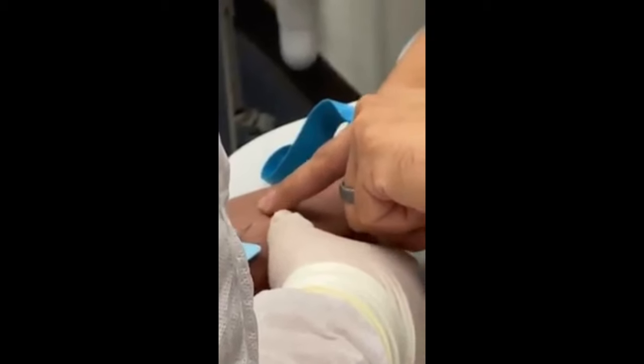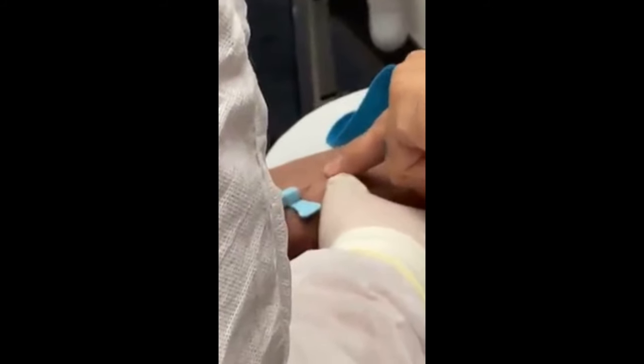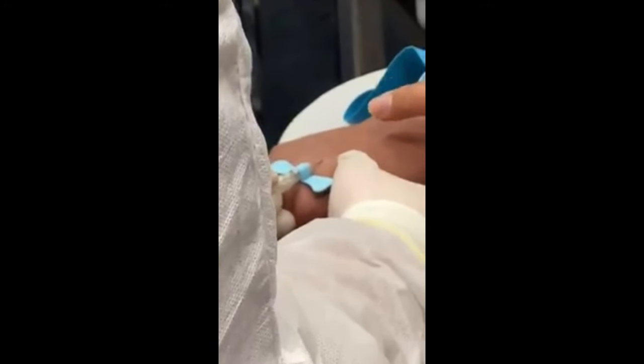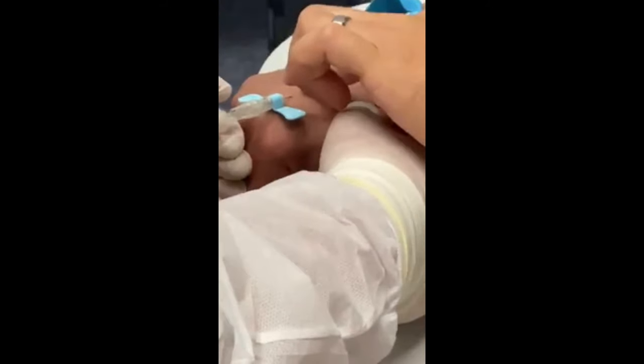So for this one here, because usually for the back of the hand it's superficial. I think you're right above it. Can I dig in again for it? Yeah, but just pull back, then realign, and then go in slowly. I think I'm right here. You got the right. You okay? Yeah, I think you're right there.